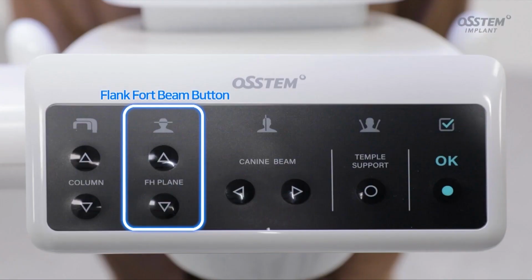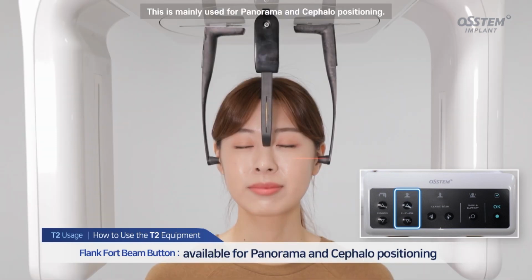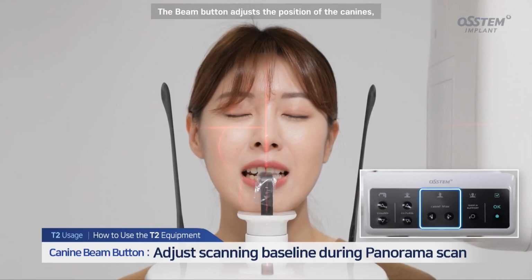Frankfurt beam button. Adjust the position of the beam to the Frankfurt line, which is the baseline for the patient scanning. This is mainly used for panorama and cephalo positioning. Canine beam button. The beam button adjusts the position of the canines, which is the starting point of a panorama scan. Press the button to place it on the canine.